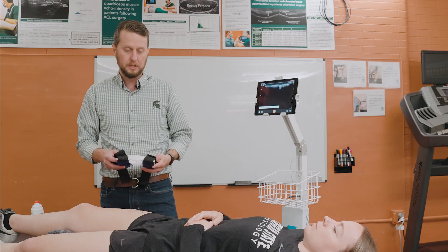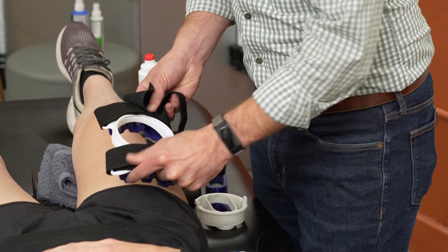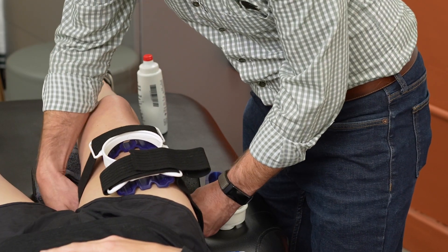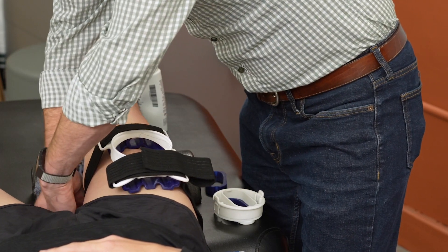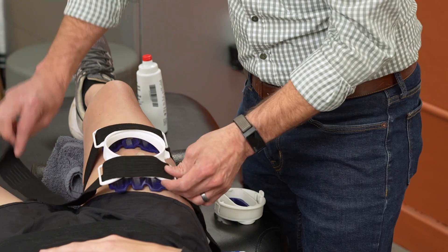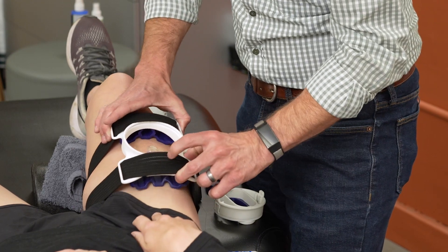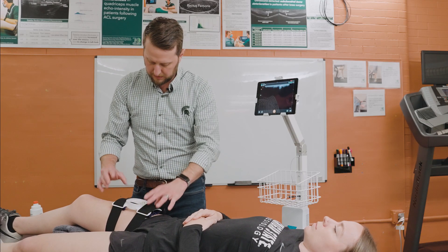Now what we're going to do is take our USONO probe fix and apply it to that location. Centering the circle of the USONO probe fix around that location, we put down our lower strap and then secure the other strap as well.